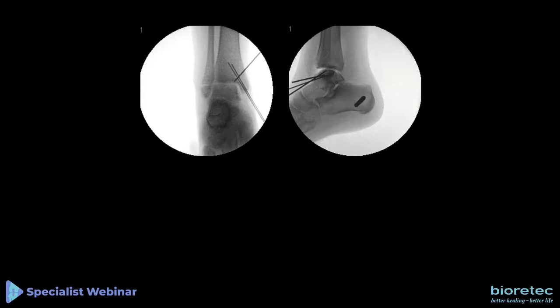And you can already start to see that the talus is starting to take shape. And this was all done under direct vision, putting the pieces together very carefully and paying really close attention to the soft tissues. There's been a lot of trauma to the area. The blood supply would have been perhaps not fully compromised, but under tension. And it's important to maintain that soft tissue handling, particularly when you perform the medial malleolar osteotomy. That deltoid blood supply, it's crucial.